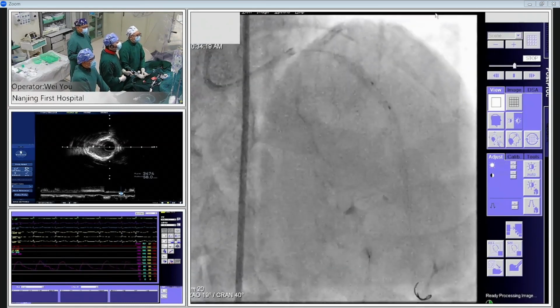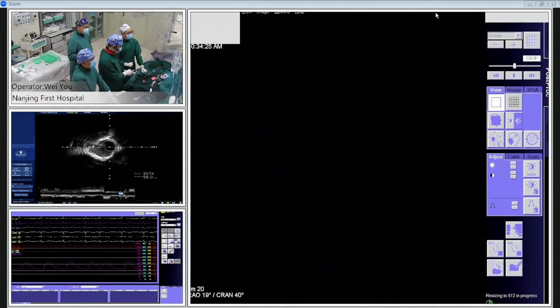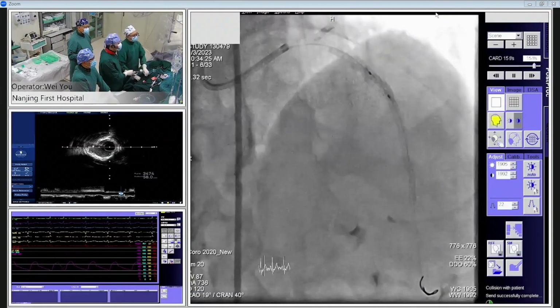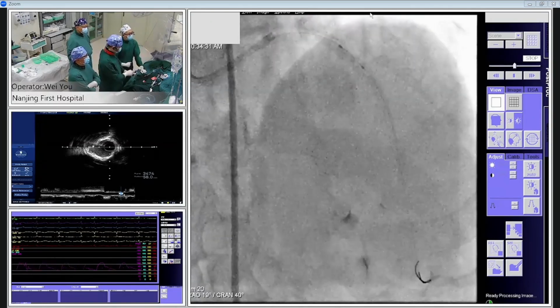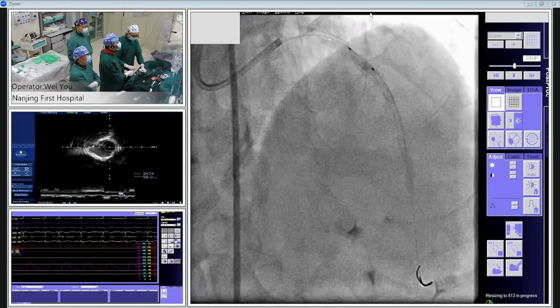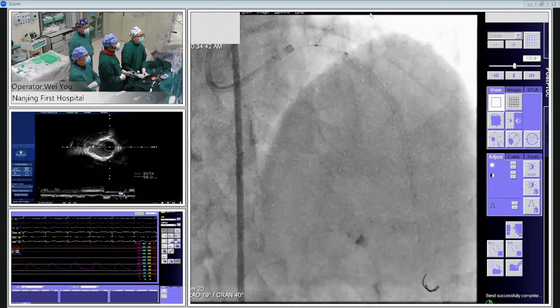We should go up to high pressure. 16, gradually, I think. 18, 20. Okay. Done. Okay, 20 please. Okay, done. It looks balloon shaped. It's nice expansion. Okay, 3.5 balloon.